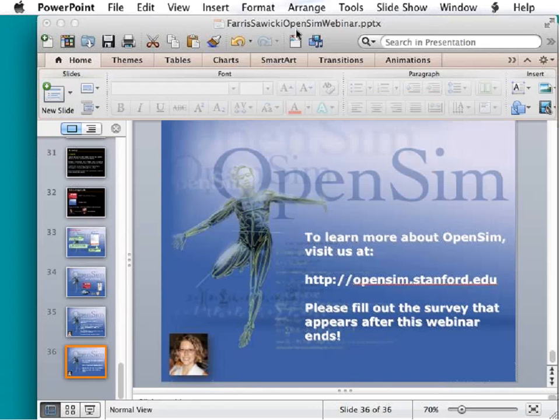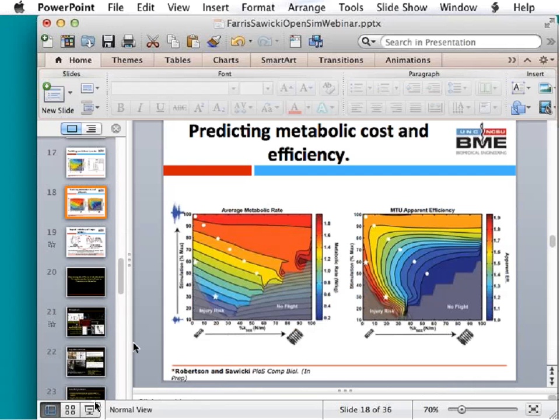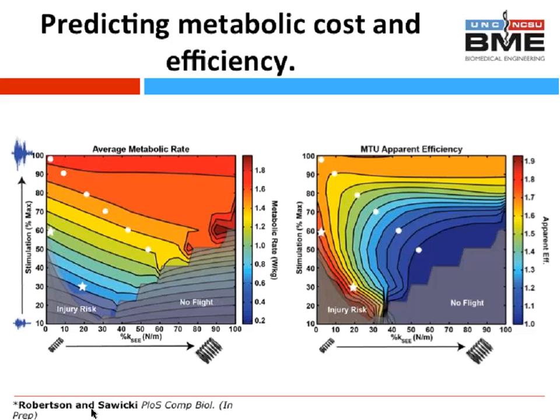Yeah, so Dom, if you can page back to the slide with the metabolic cost contour, I think we don't know for sure what would happen in the ankle device. What we do know is that when Elena and Hugh Herr put a stiffer spring on their whole leg device, the metabolic cost actually did not drop as much as with a more compliant spring. So it seems like there's some motivation that there might be a sweet spot. You don't want to be too compliant, but you also don't want to be too stiff.